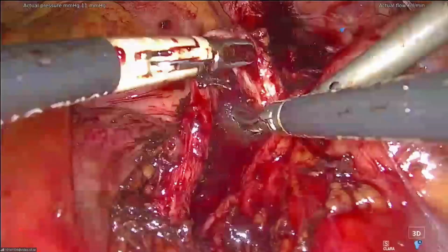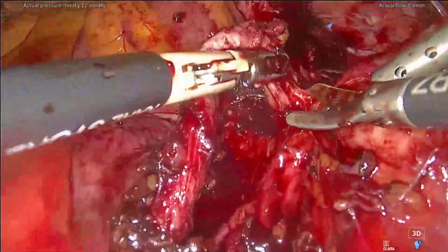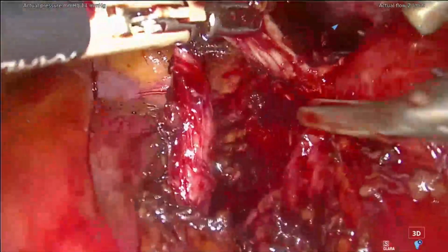And I arrive really close to the bladder now, and it's a bit strange because I don't see the turn. It's maybe because it's so fibrotic here. Whoops, I'm on the other side. Or I'm inside the iliac. No, I'm on the other side. And this is the stenosis. It's really the anastomosis. I will put a clip here, please.